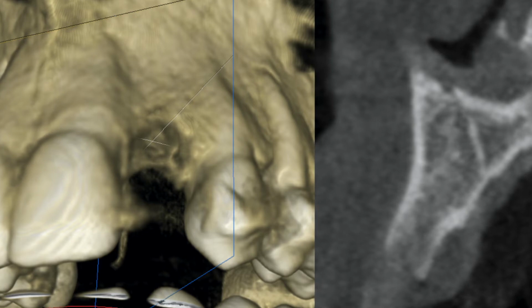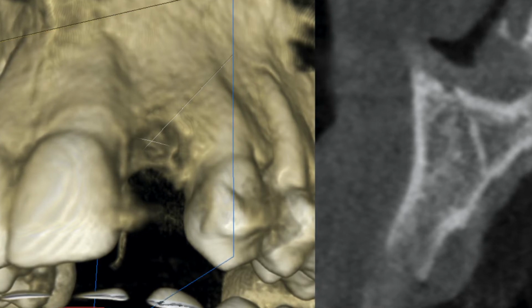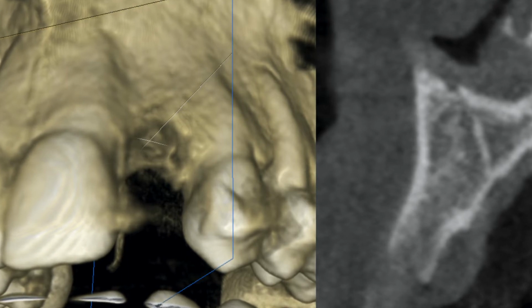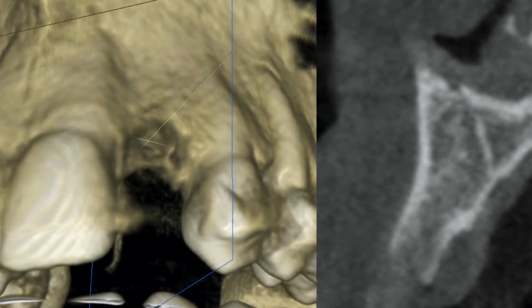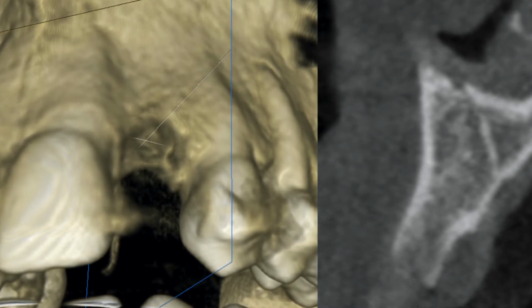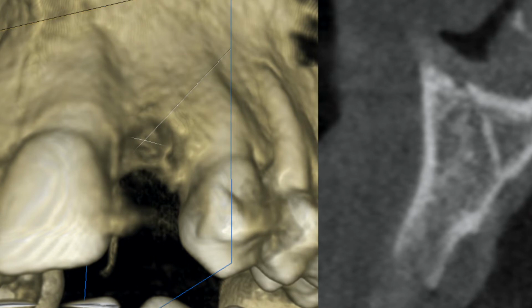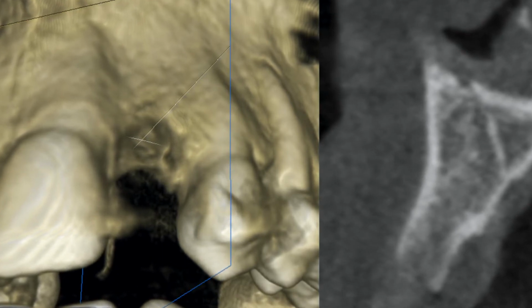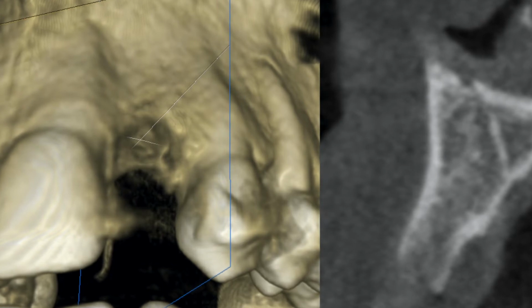However, if people only looked at the radiograph or scan on the right, and they weren't thinking restoratively, they would say, I have adequate bone volume to place my implant. And if we were doing implants 10, 20 years ago, I guess that's okay. But it's not okay now, because the marriage between the two of us is critical.